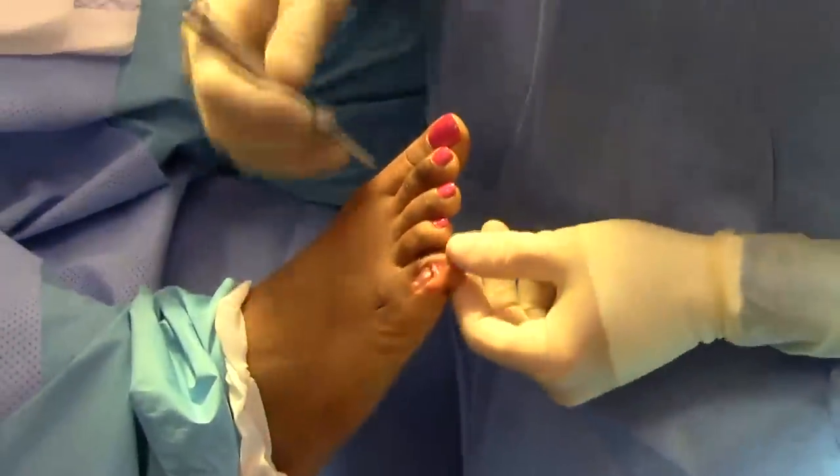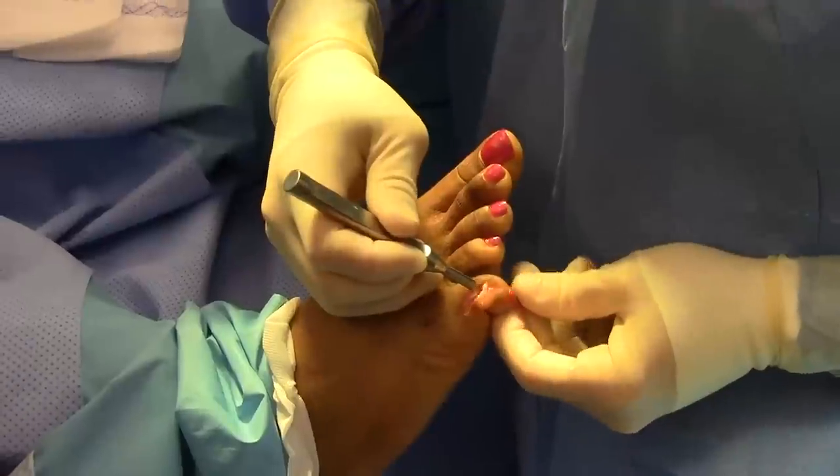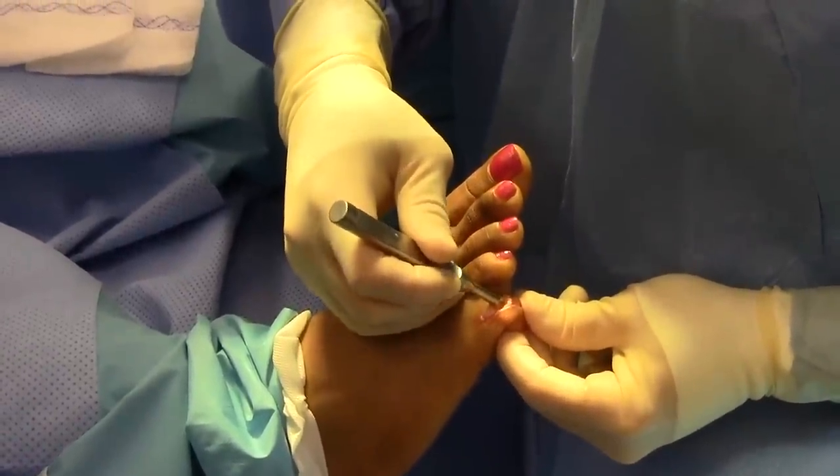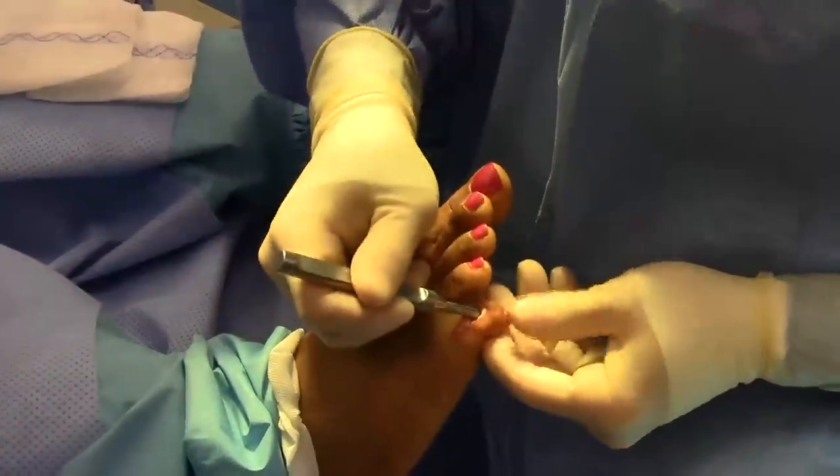Once the joint is resected, this is a broach that we use into the middle phalanx to prepare the bone for the implant, and it slips in there very nicely — it's a very sharp broach.